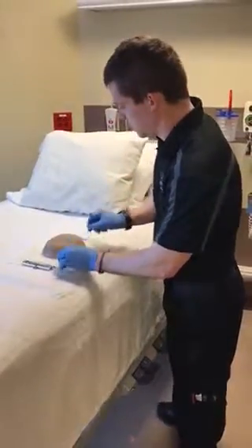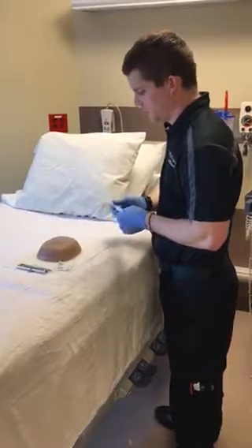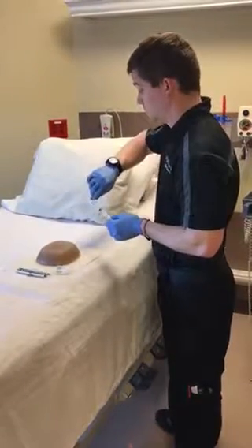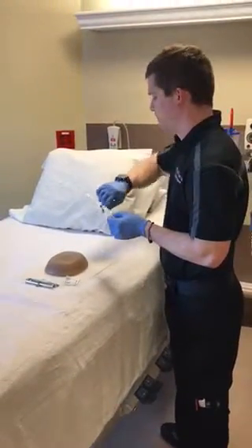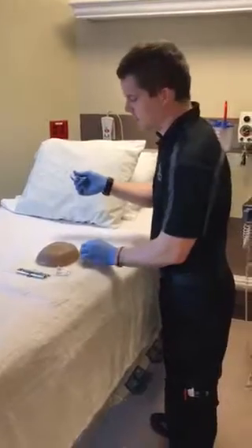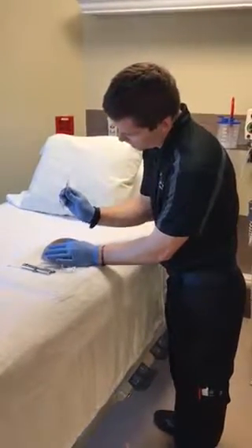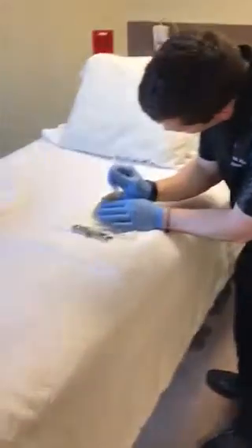Set that to the side. I'm going to let that dry for 30 to 45 seconds. I think it's dry. Okay. It's been 30 to 45 seconds. I'm going to remove the needle cap. I'm going to secure the site and insert the needle at a 90-degree angle.